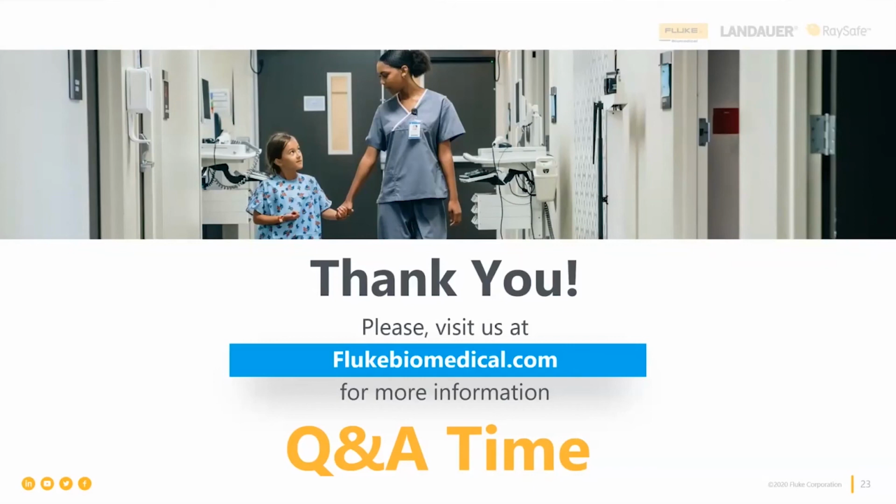Yeah, no, it's just how many maximum discharges that battery will be able to supply, and that's why the batteries have a limited life in an AED. It's different in a full ACLS defib because they're sitting on a charging stand if they're going to be used in a grab and go situation, and those batteries can be recharged, but that's typically not so much the case with the AED. Batteries might be able to be recharged, but typically not. So yeah, you have to have the spare batteries, but it's not going to affect the capacitors inside.